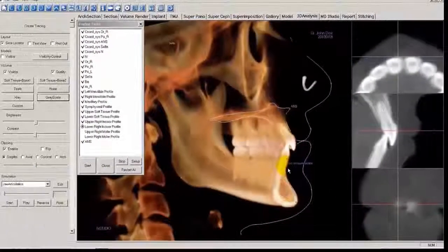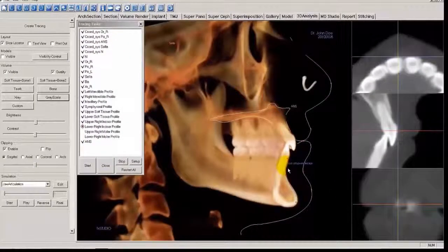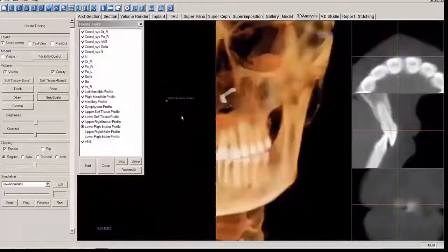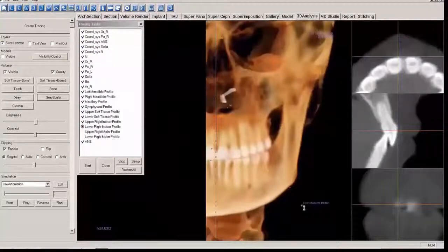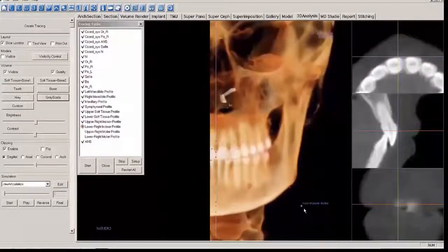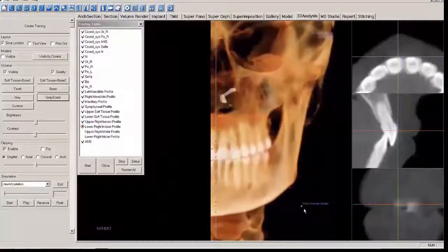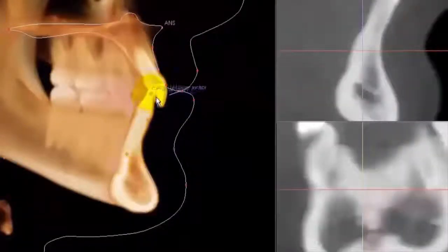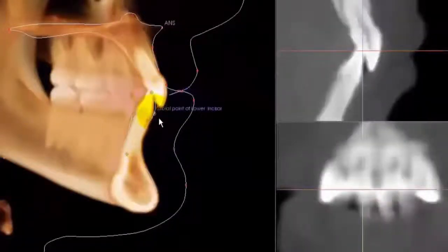Now do the Lower Right Incisor Profile. Change to the front view, use the scroll wheel to go right through the mid part of the crown to the apex. Click on the right view. Then click on the apex of the root, the crown, and the labial point.